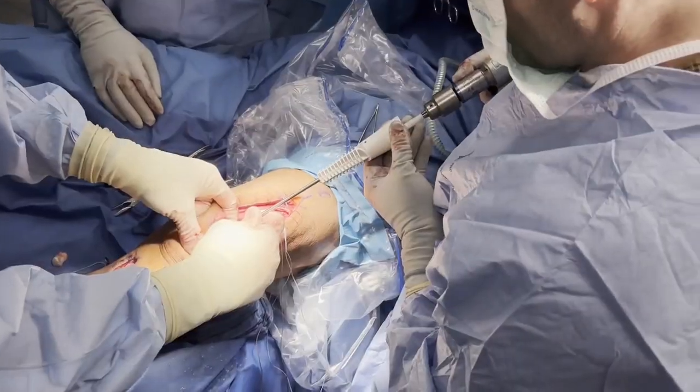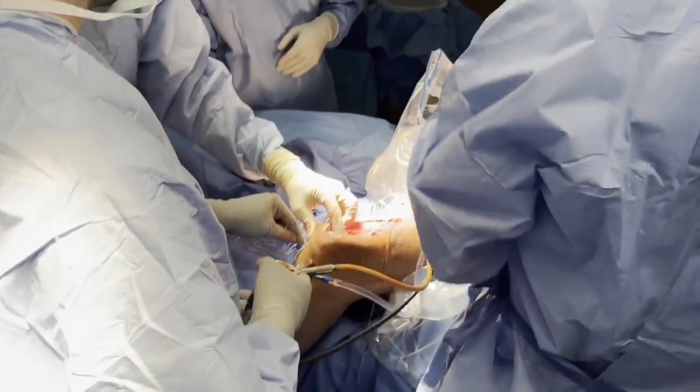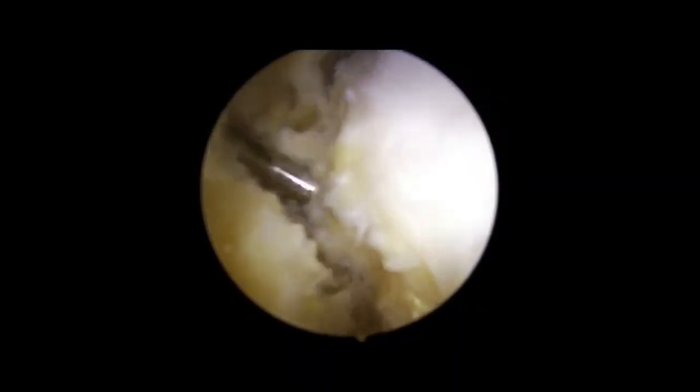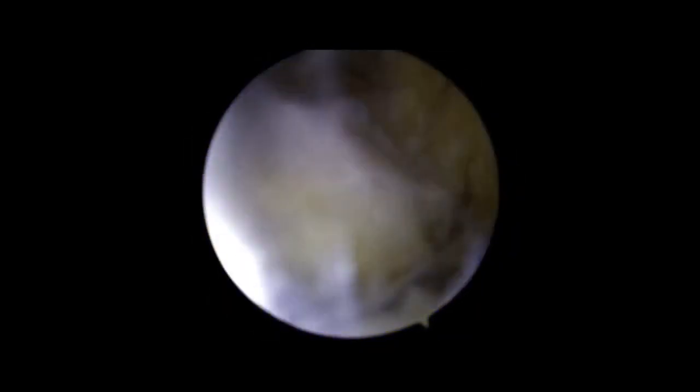Three Q-fix anchors are then placed at the decorticated superior pole of the patella. Arthroscopy is then initiated, and an extensive anterior interval and fat pad debridement is performed to release the patella and allow proper restoration of patellar height. The knee compartments and injured articular structures are evaluated at this time.